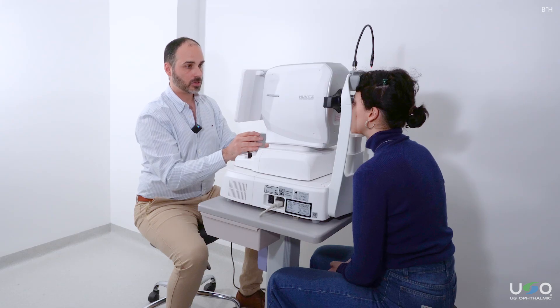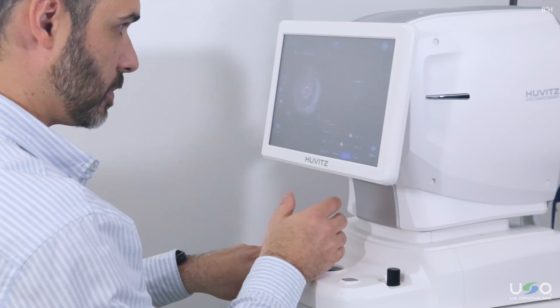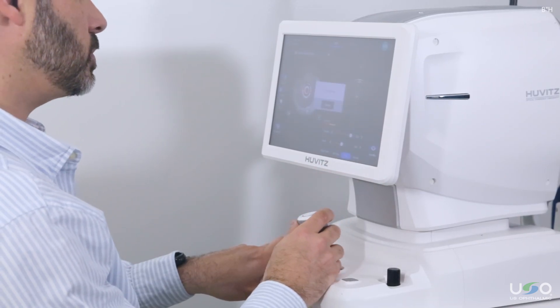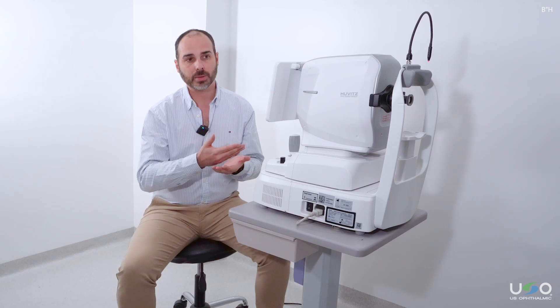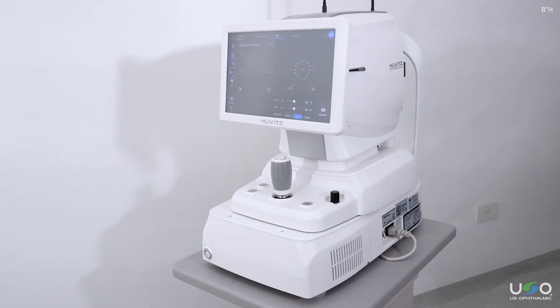So, if you seek to professionalize, to improve, to have a validation of the measurements you take in your current practice, I believe that a biometry module is the ideal candidate for your case.